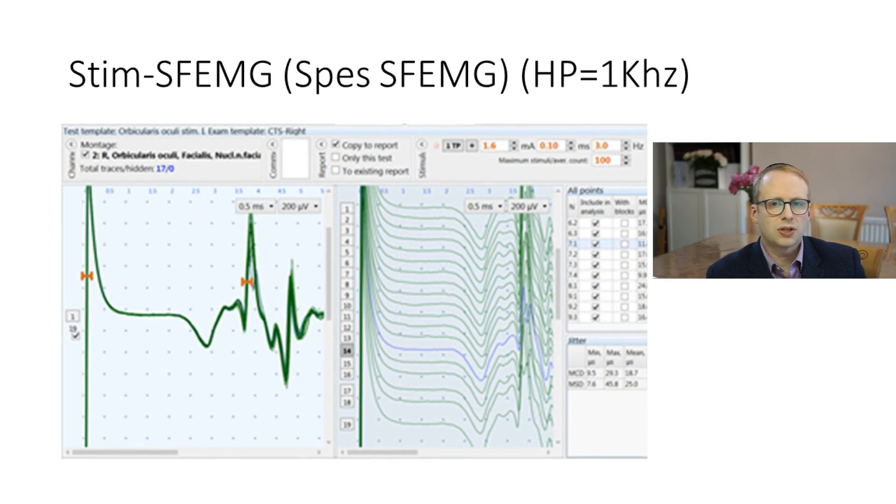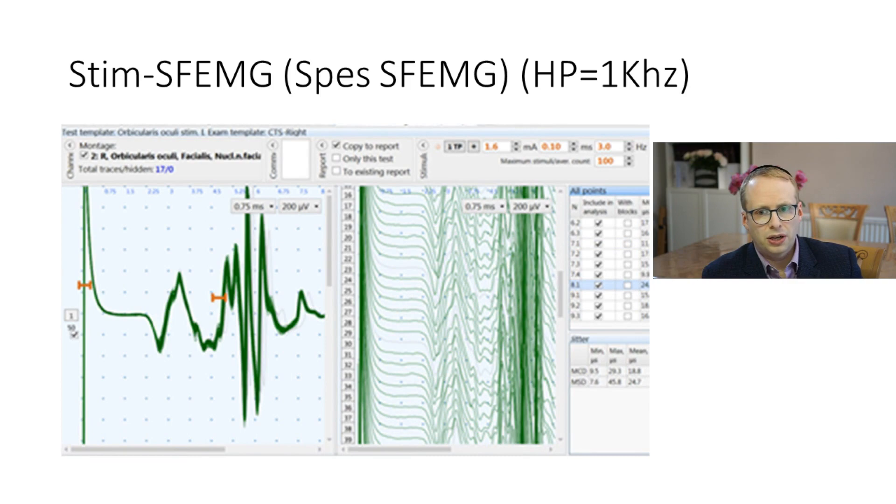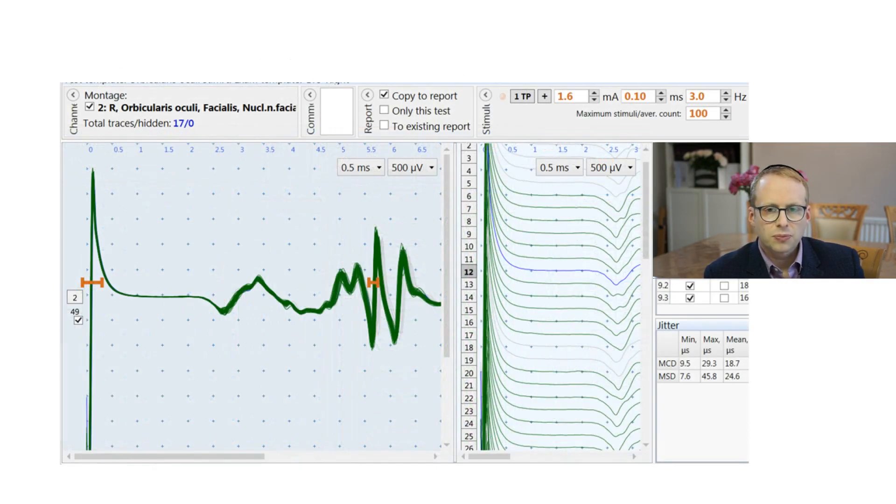What I ended up doing was actually increasing the high pass filter to one kilohertz, just as I would with the facial concentric needle electrodes. Almost immediately, one has a cleaner study that needs less processing thereafter. The next thing to say is probably one of the most obvious points: the amplitude is staggeringly larger than for the concentric needle electrodes — on the order of two to three millivolts in size. Contrasting that with the study published in the previous video, it's really important to get your recording zone very close to where the originating fibers are. If you don't have the recording zone right next to the originating fibers, one actually has a very significant drop down in amplitude.